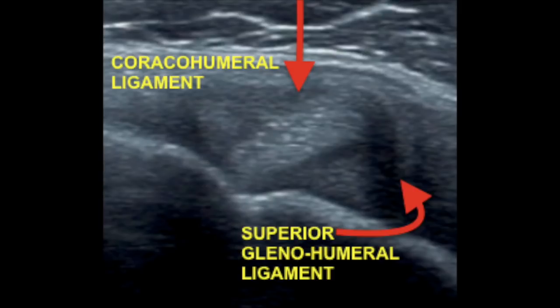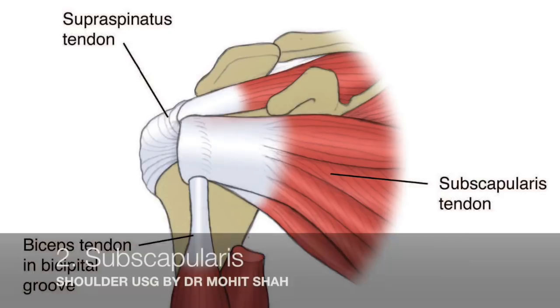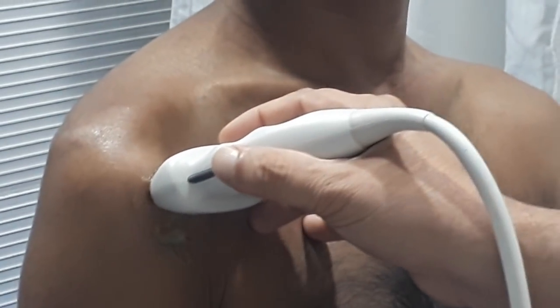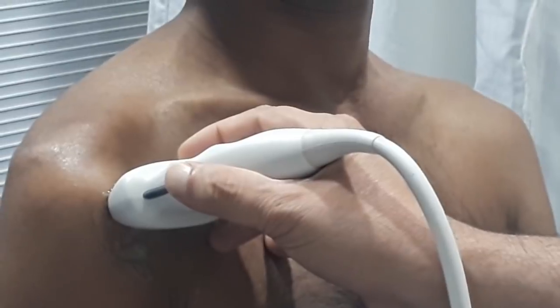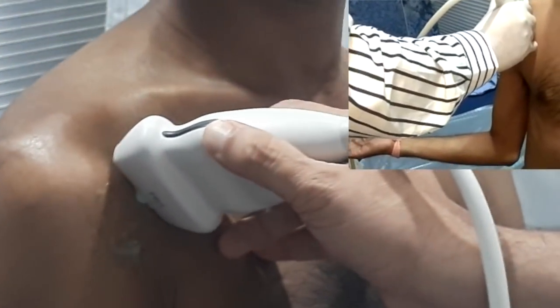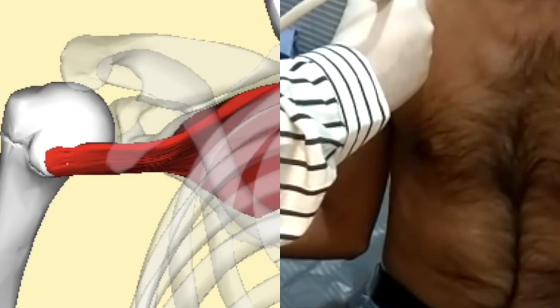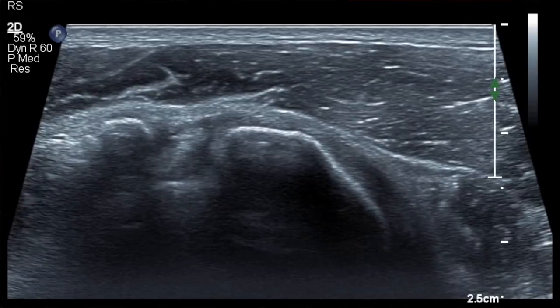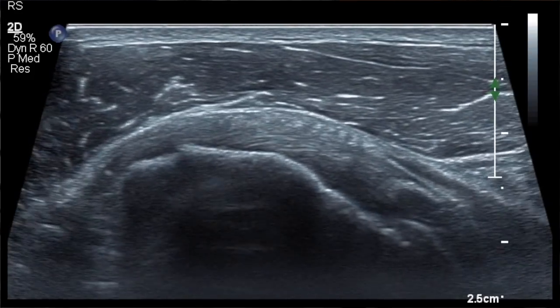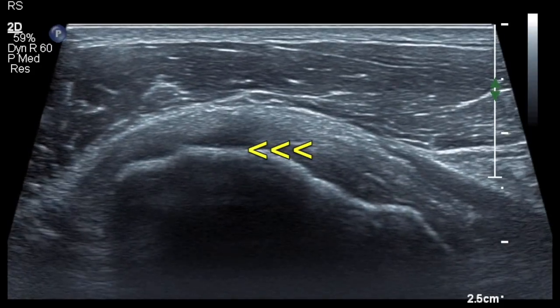The next thing that you would like to evaluate is the subscapularis tendon. As you can see in this video, we keep our probe on the lesser tuberosity and you externally rotate the forearm, keeping the elbow abutting the torso. It is only an external rotation of the forearm that will get the subscapularis out of the scapular and bony ribcage, so that you can visualize the entire subscapularis in its long axis with its insertion and footprint on the lesser tuberosity.